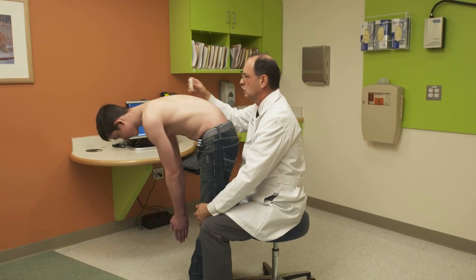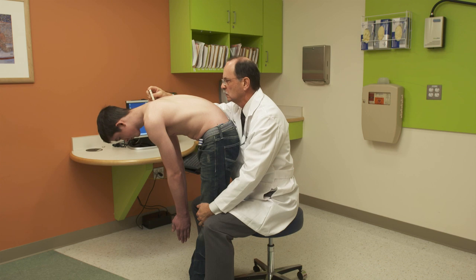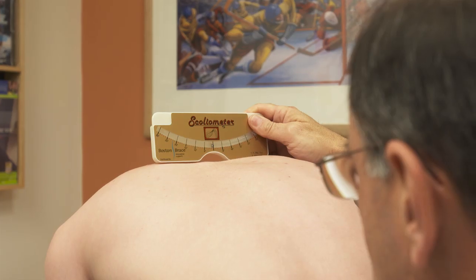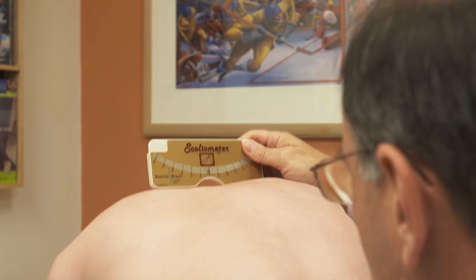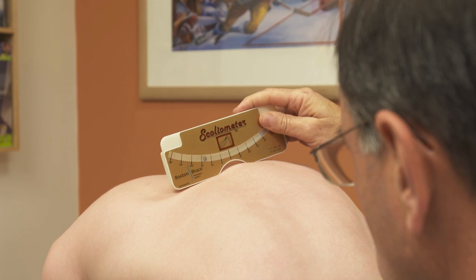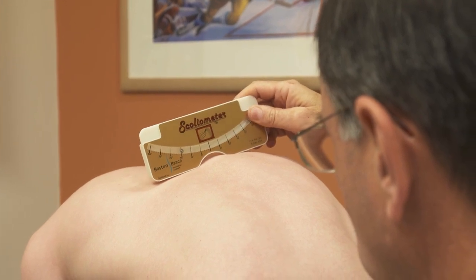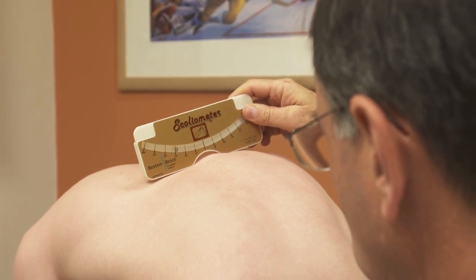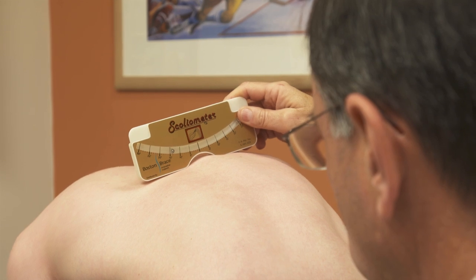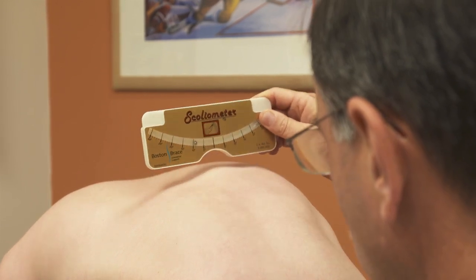An inclinometer can be used to quantitate the torso asymmetry in the chest region at the horizon as the patient bends forward. The cutout of the inclinometer should be centered over the posterior spinal process so that the device rests on both the right and left rib cage.